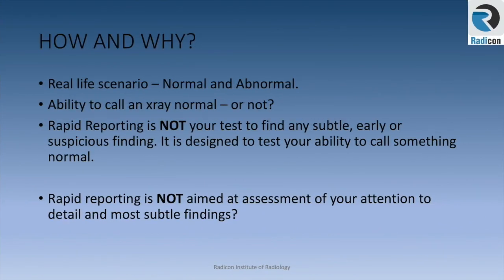To pass the rapid reporting component of the FRCR exam, you must understand the basic concept. Rapid reporting is not your test to find any subtle, early, or suspicious finding. It is designed to test your ability to call something normal. This is so important that I'm going to repeat it. Rapid reporting is not your test to find any subtle, early, or suspicious finding. It is designed to test your ability to call something normal.